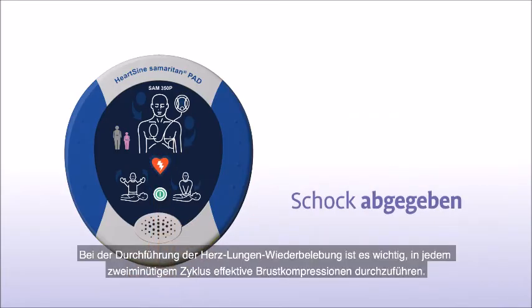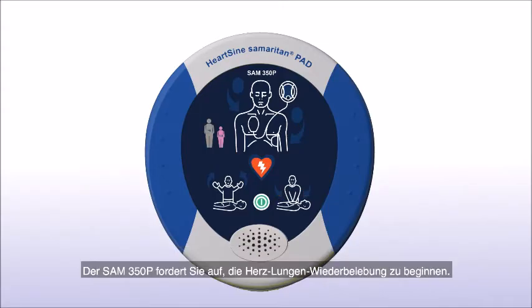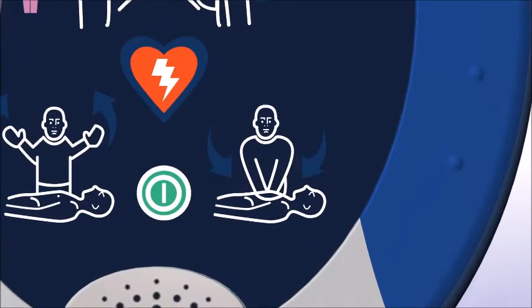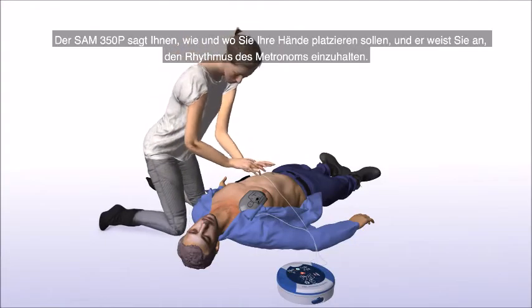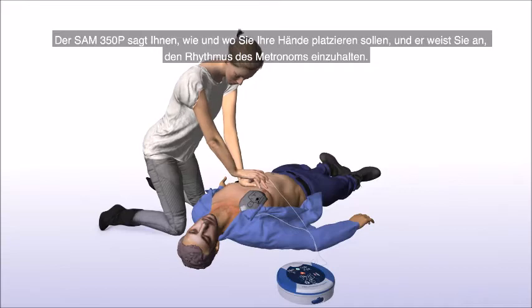When performing CPR, it's important to apply effective chest compressions for each 2-minute cycle as directed. The Sam 350P will prompt you to begin CPR, tell you how and where to place your hands, and instruct you to keep in time with the metronome.